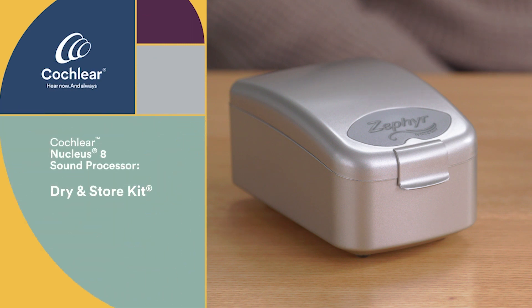This is the Dry and Store Kit. You'll use this each night to dry your processor to keep it operating efficiently. The maintenance video will provide additional instructions on how to get the device set up correctly for the first use.